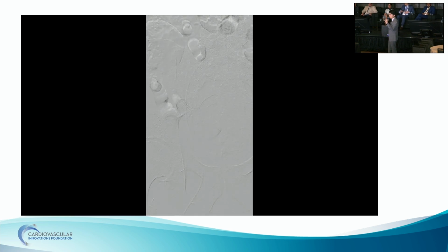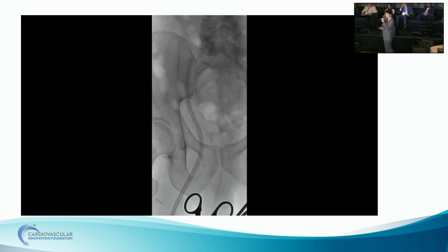And here's the case. We obtained access in the distal bypass, which is shallow for us to access. That was in a retrograde fashion, the bypass crossed, and we're using this Penumbra Lightning catheter to go into the aorta on the ipsilateral side under guidance. This was after the first pass, and you can see that there's a residual thrombus. We had a second pass through this and actually had a really good outcome, which you'll see soon.